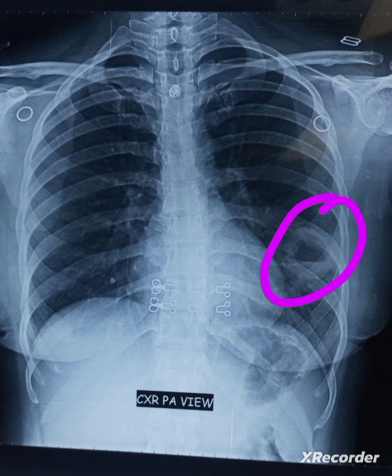So there is a thick-walled opacity with an air-fluid level lying in the mid to lower zone. In a chest X-ray, you have to use the word 'zone,' not 'lobes.' These are the basics of X-ray. You can watch the basics of X-ray on my YouTube channel — there is a complete playlist on the basics and X-ray for beginners.